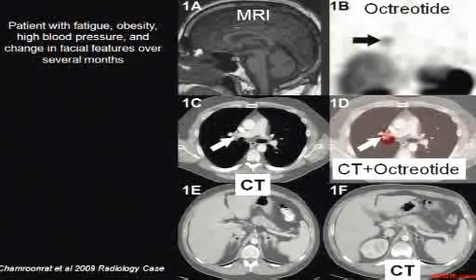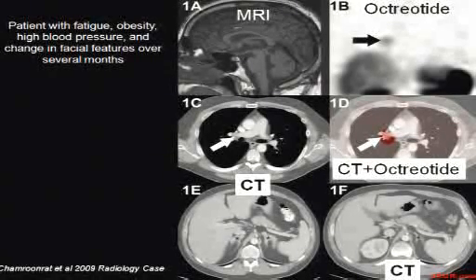This was taken out. 6 months later, a follow-up CT was acquired. This, of course, was removed, which was the purpose, but also the adrenal glands returned back to normal size. So in fact, this tumor was secreting a stimulatory hormone that stimulated the adrenal glands to cause all of these symptoms in the first place.